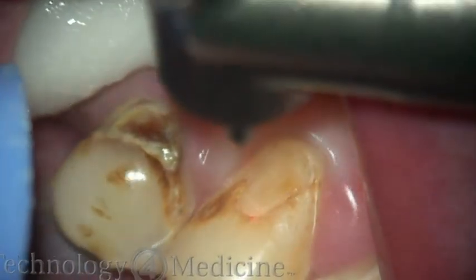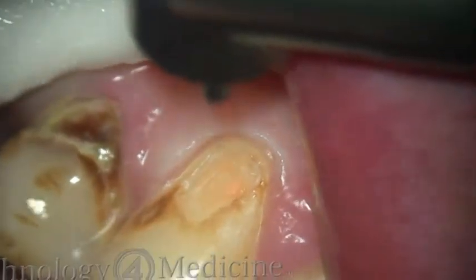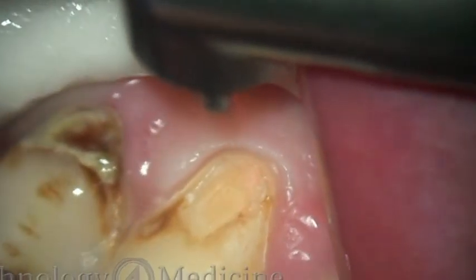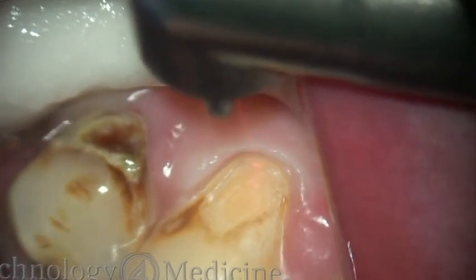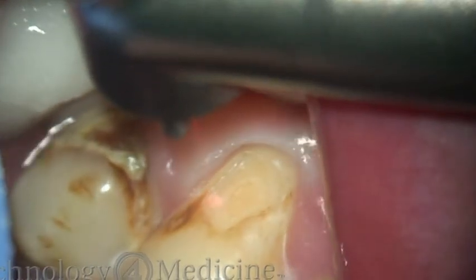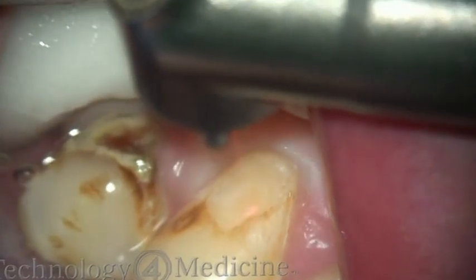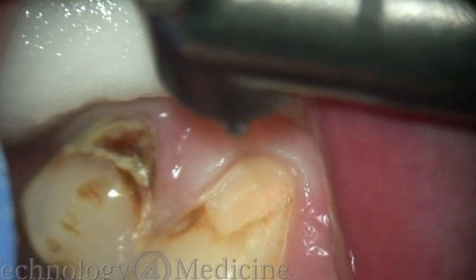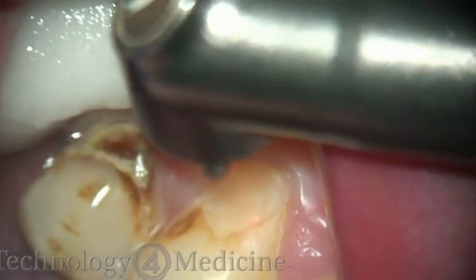This setting also allows for precision removal of decay and decalcified tooth structure. Once you learn how to use the laser — which we teach in the advanced training classes — you learn how to place either a bevel, a butt margin, or whatever type of margin you're looking for with your final restoration before you place it.